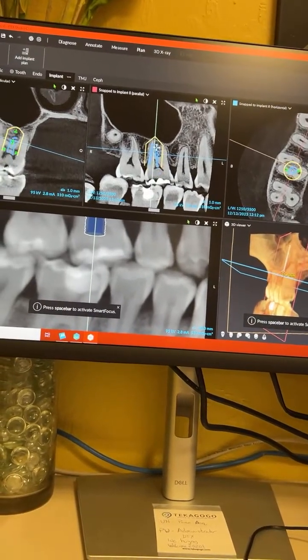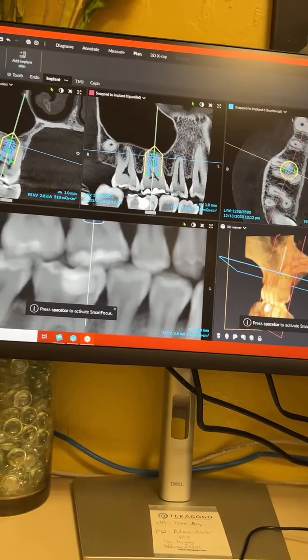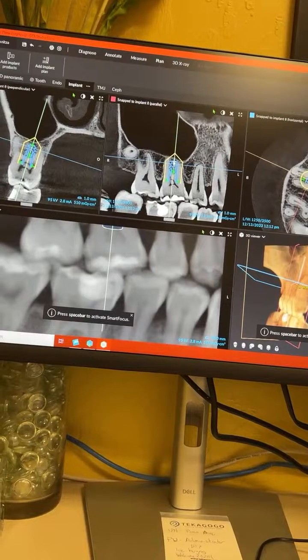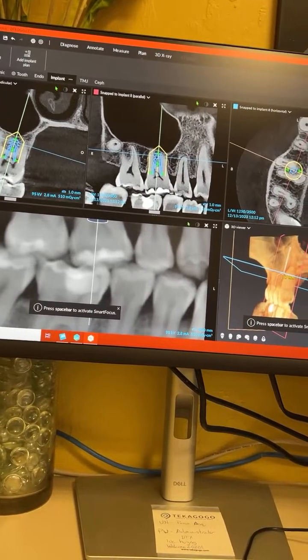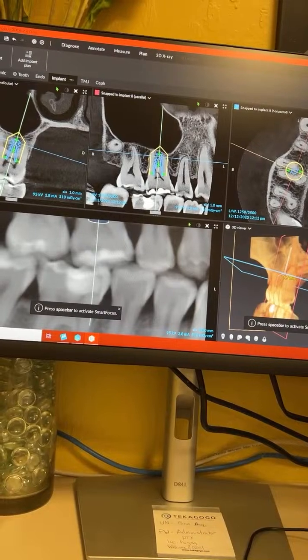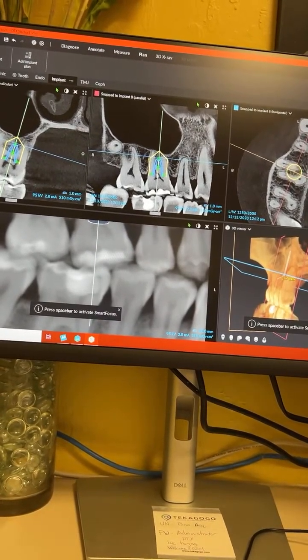Does it tell me what size I need? It won't tell you what size you need. But you can just put the size in and then look at it, obviously seeing your perfing there. You enter the size, and then they will tell you how it looks in there. This is giving you planning ideas. So you're looking at this saying, I know what size implant I can place in this area. So maybe in some cases you'll have to do some grafting. Yeah.